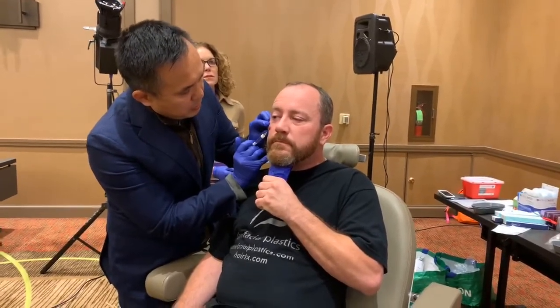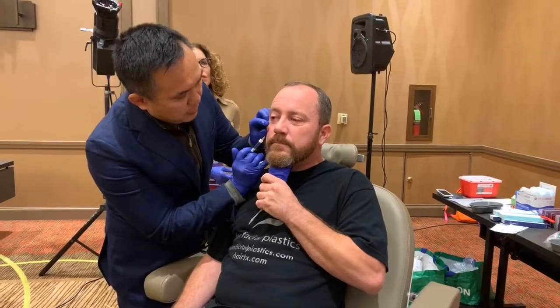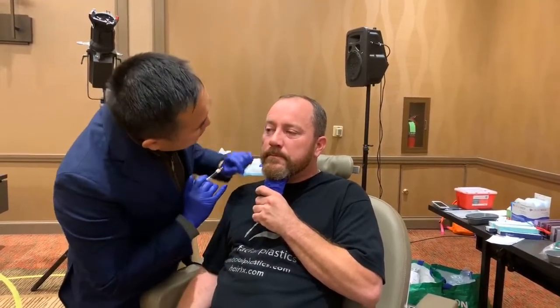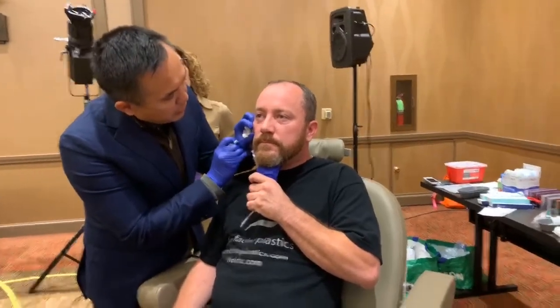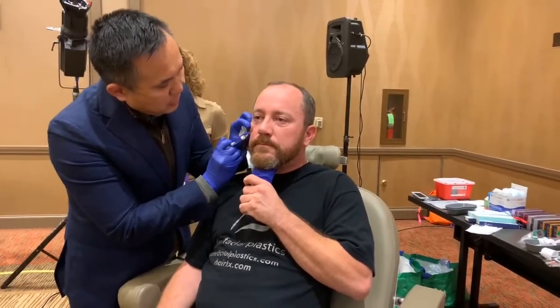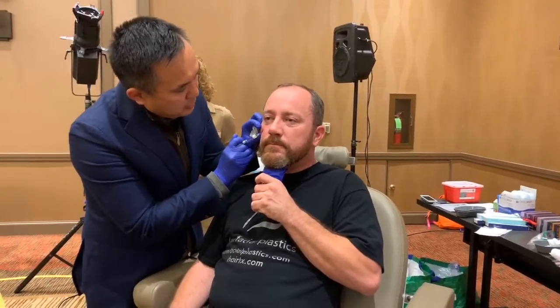You can see how much of an impact it already has — patients always sitting. We're just filling this up and you can start seeing the changes. We're going to access it — there's still some hollowness below the orbital rim. I think this is a critical element: look below where you're filling, because there's a dip below the orbital rim. We're going to put a little bit more just below that, so it's actually below the orbital rim. I'm not a big fan of anterior cheek fills — I think it can get a little cheeky, especially for a gentleman. I'm just buttressing the area below the orbital rim to get a better result.